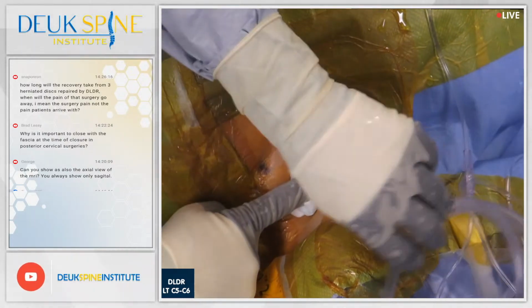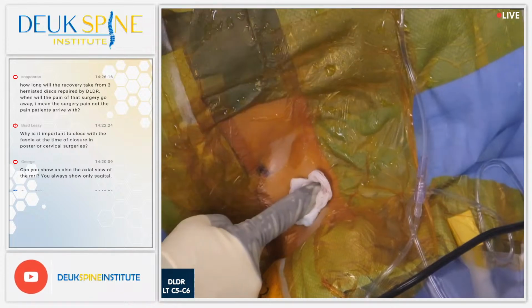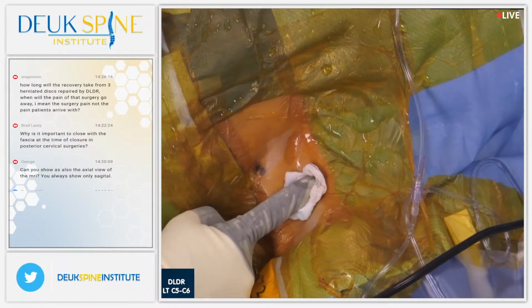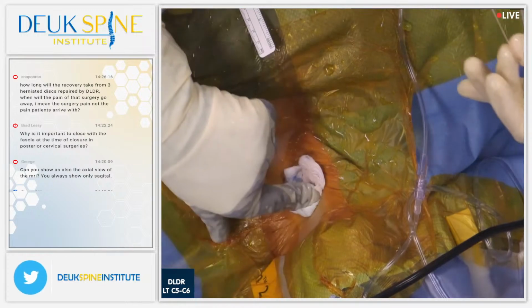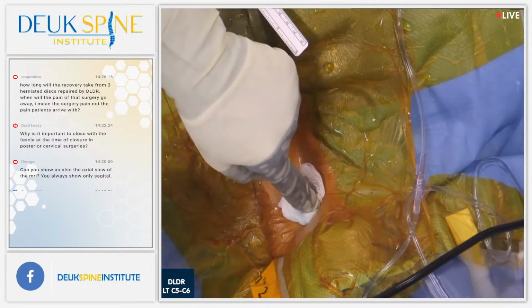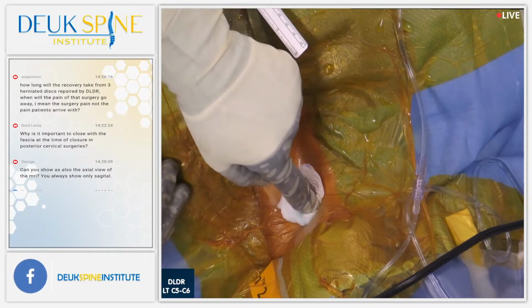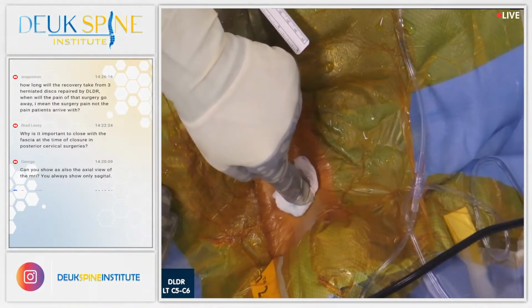So we're done with her surgery, and I have my finger on the incision. I'm just holding pressure. Sometimes you get a nick on a vein and the vein wants to bleed. Other times you don't. It's a 50-50. But if you get a nicked vein, all you got to do is hold pressure for 4 minutes or less and the bleeding stops.